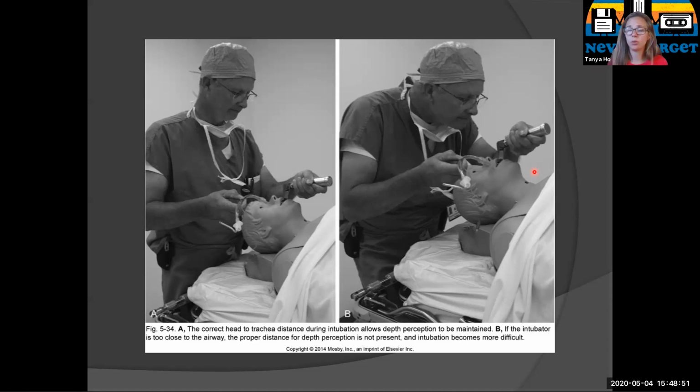So they have difficult airway algorithms, and I could share one with you. But generally, if you can't get your intubation within a couple of attempts, you should be trying something different, okay? And buying you some time until you can get something else done.